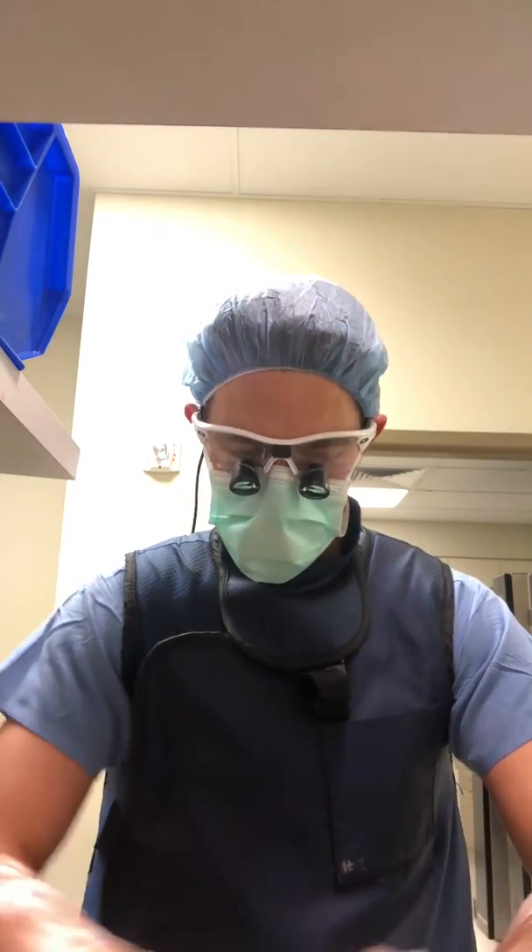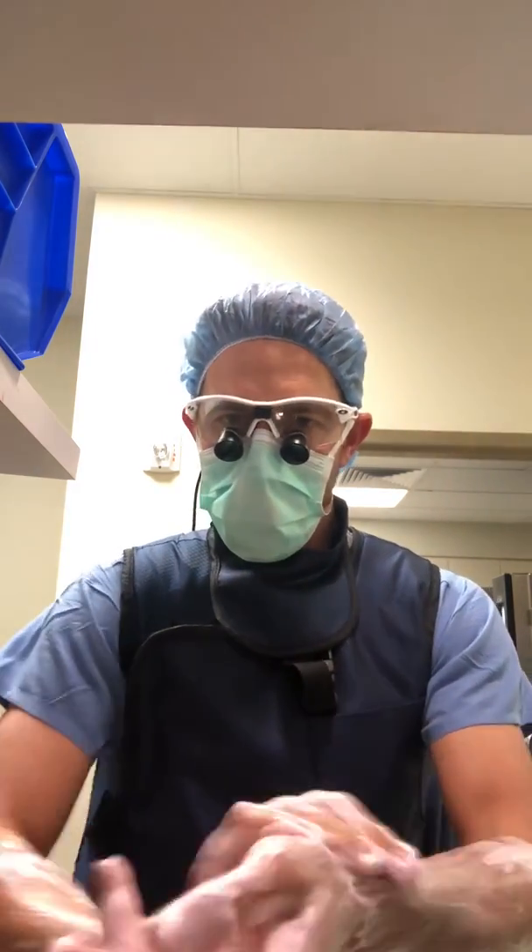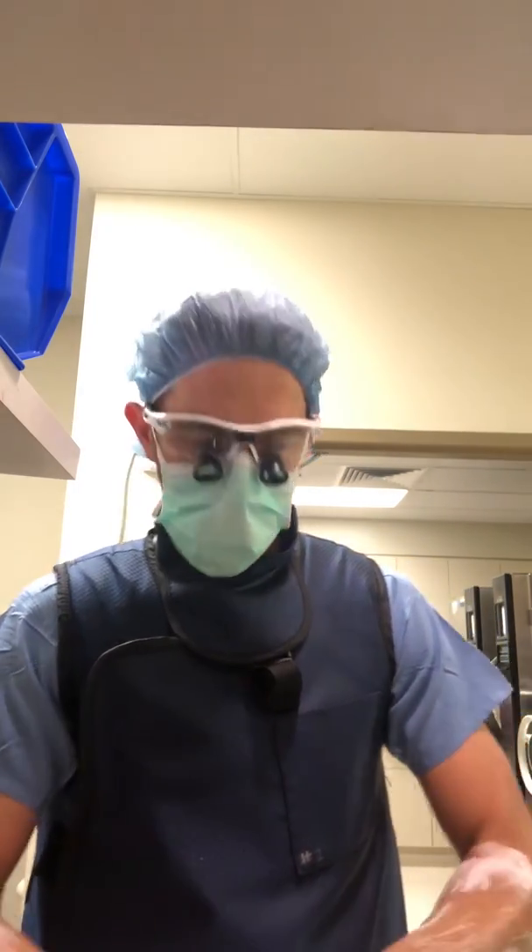The product I'm using is a Sentinel Spine ProDisc C spacer. It's a great product, been around for a long time, and has some unique biomechanical components that I really like — that's why I use it. More information to come.